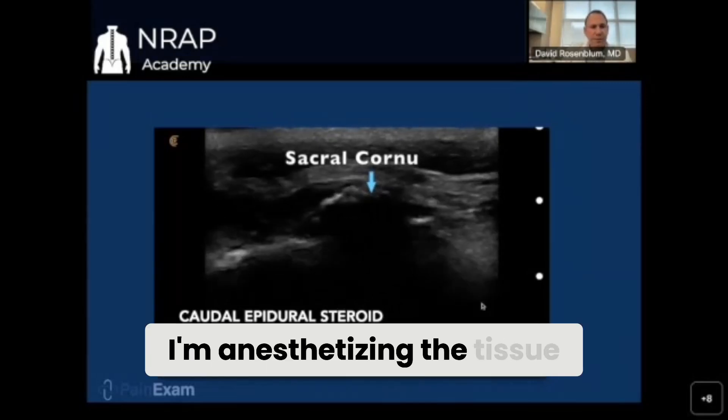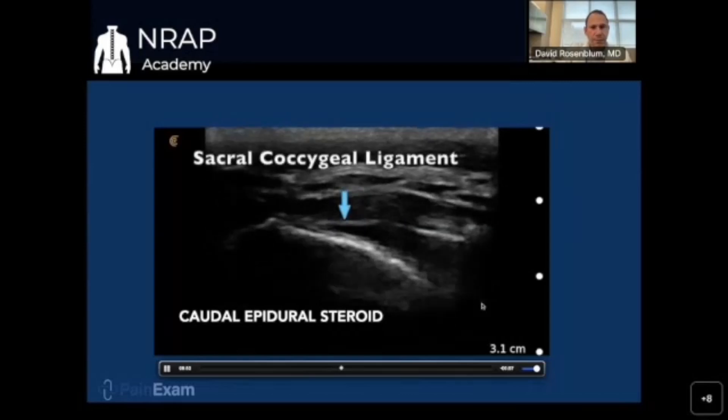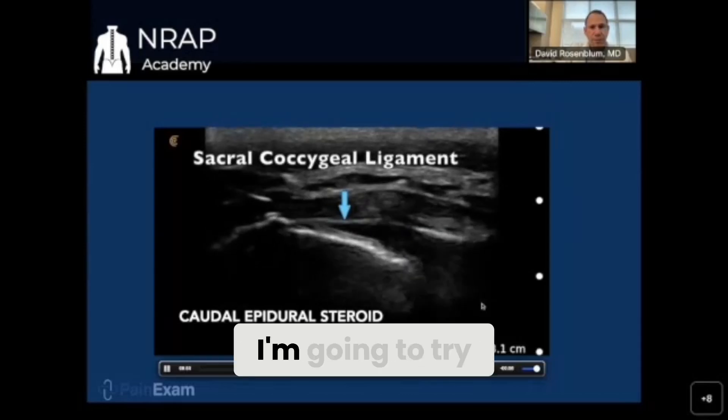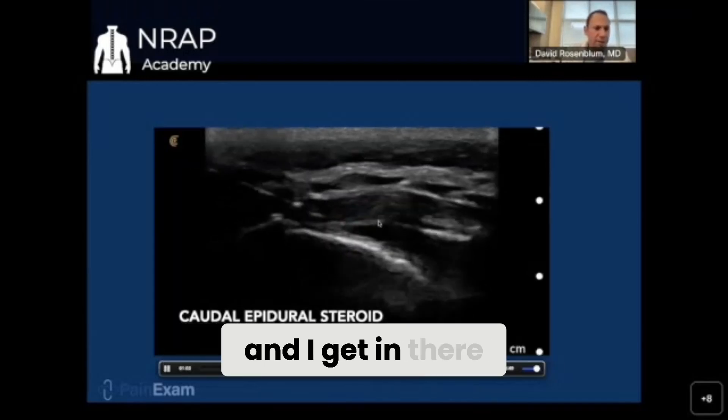My needle's coming in and I'm anesthetizing the tissue. There's the sacrococcygeal ligament. I'm going to try to get in there — I actually wind up hitting the bone on top, then I redirect and get in there.